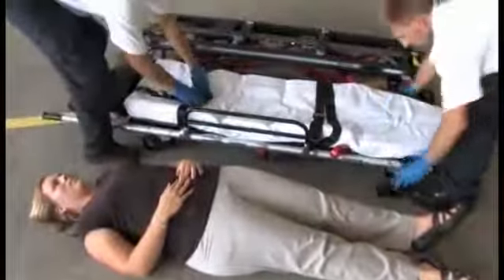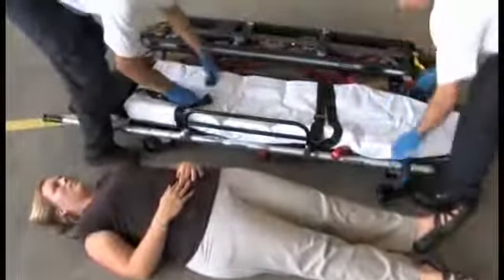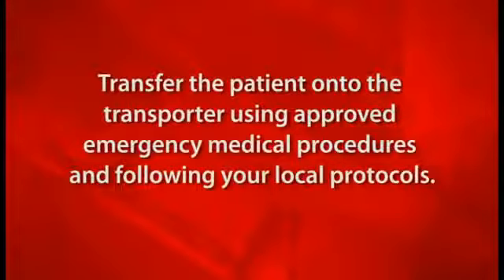Unfasten the restraints and lay them to the side of the bed surface. Then lower or fold the side arms down. Transfer the patient onto the transporter using approved emergency medical procedures and following your local protocols.